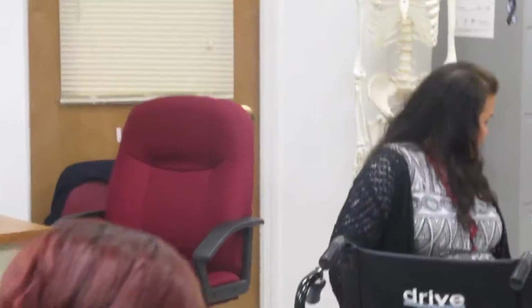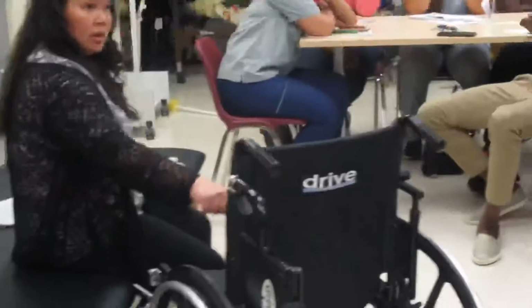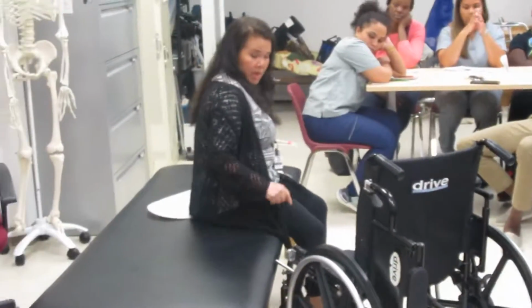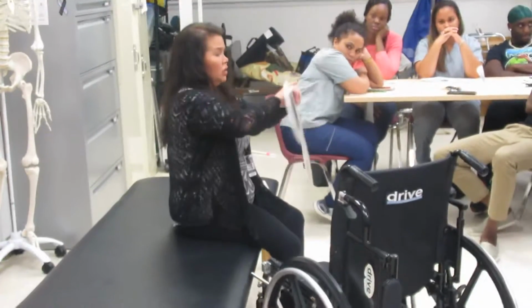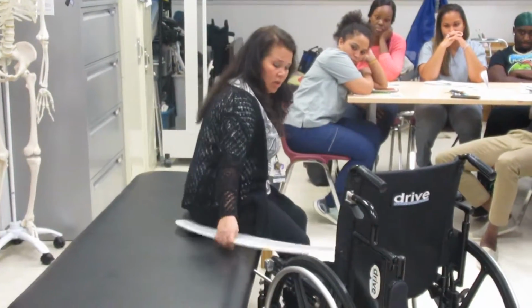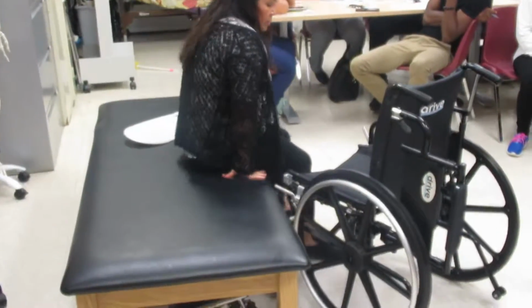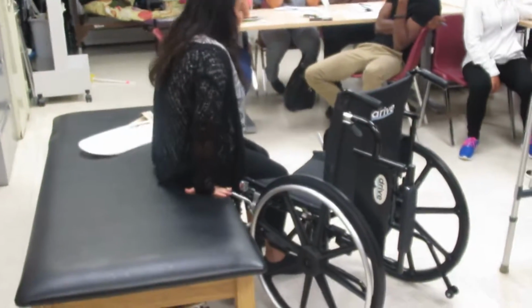Okay, so, again, if I'm going back to the chair, I have to swing away the armrest. Get as close to the surface as possible, because it's still 30 to 45 degrees, right? If I'm here and I'm too far away, I go to do the transfer and put this here, and then I could fall right here, because it's just too far from the surface. Always go towards the surface as close as possible. Bring the patient closer, have them scoot to the edge.